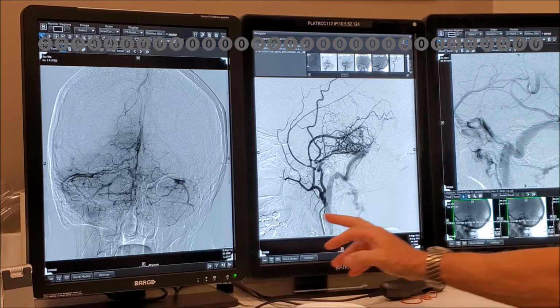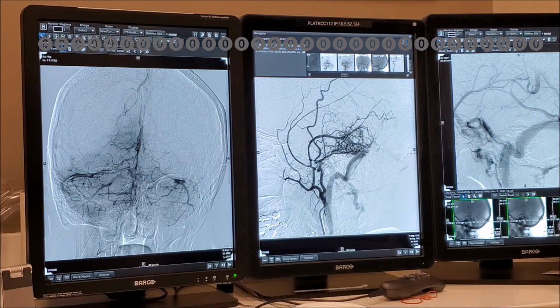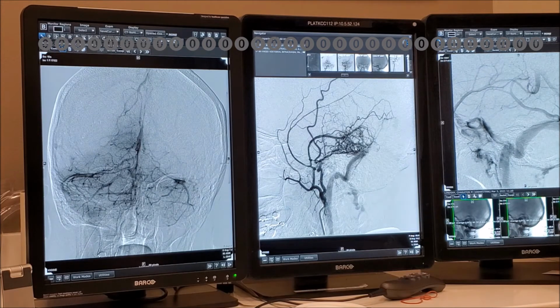And you would probe it. You would come in like this, and you would poke around, and you probably will find this. If you find this, then boom, boom, boom, you go there. You can guide yourself. You can put a catheter to guide yourself at the highest point. Look at all the externals, which is the highest point.